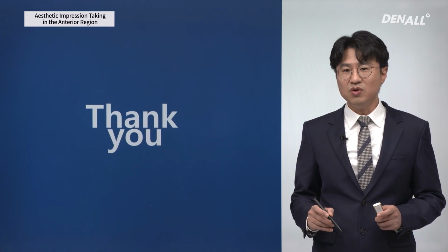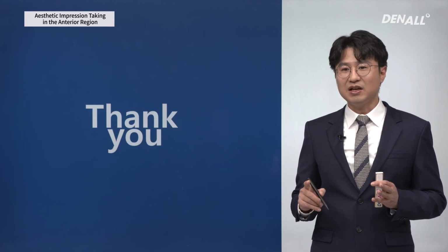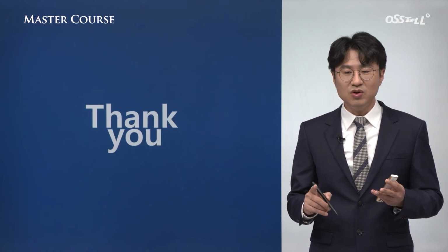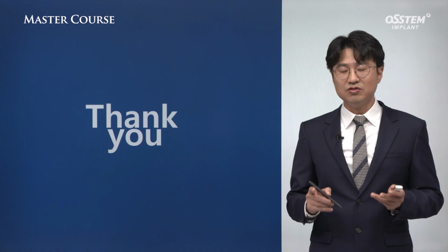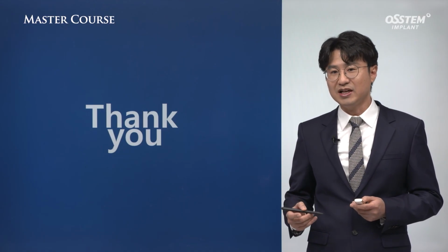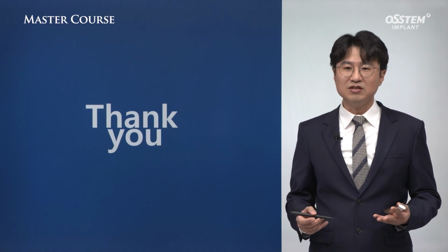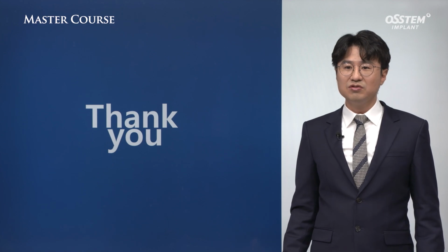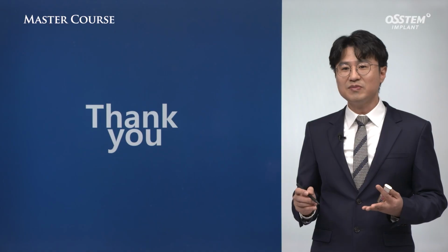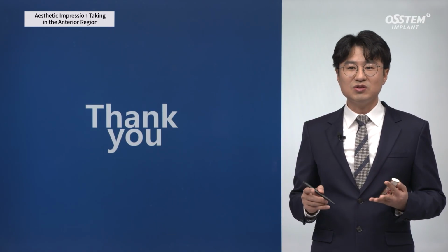For a single restoration with a palatal screw hole, extraoral cementation is used. And for multiple restorations with a splinting, it is never cemented extraorally. Abutments are first connected, cemented, and the prosthesis is removed using the screw hole, and cement is removed to achieve passive fit in multiple cases. I usually use a screw type connection, so there is really not serious problem with this residual cement.